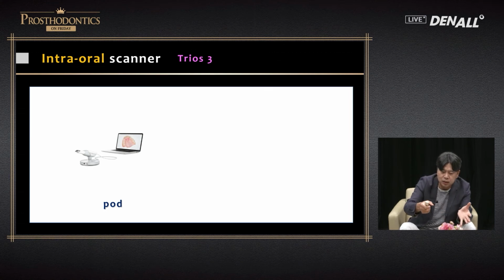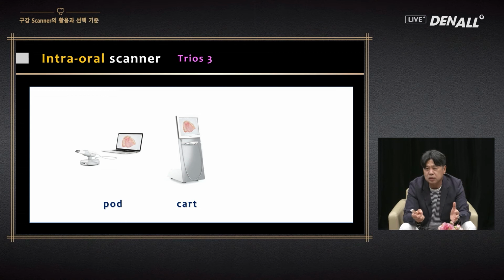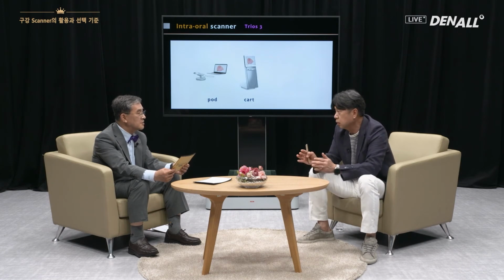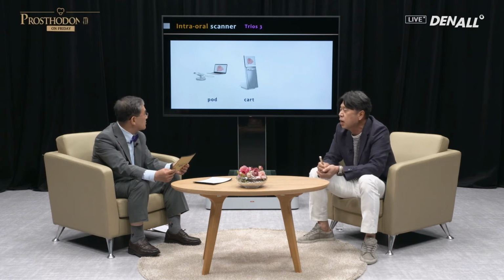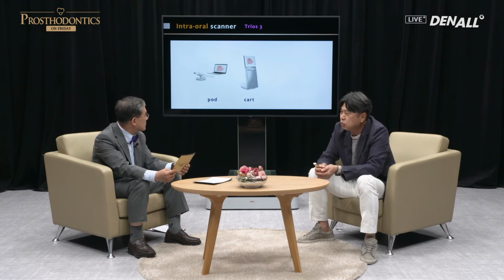Pod type, the laptop and the pod can be moving between the chairs, and there is one body integrated type, the cart type. You can impress patients with this cart type, the state-of-the-art looking cart type. The disadvantage of that is that it is difficult to upgrade the computer, like a graphic card or CPU, because they're all in the body. But in the case of the pod type, you can just upgrade your laptop.